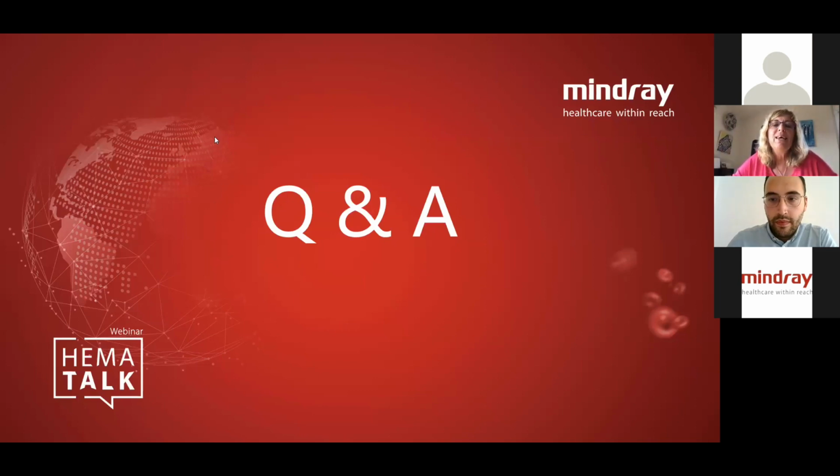okay? Because the only problem is that you need to have a very good staining. If the staining is not good, you are not going to see red cell abnormalities on CellaVision, on the microscope, on any system. See, the first rule is obligated, staining perfect. If the staining is perfect, I think that you can see very well the morphology using the CellaVision.